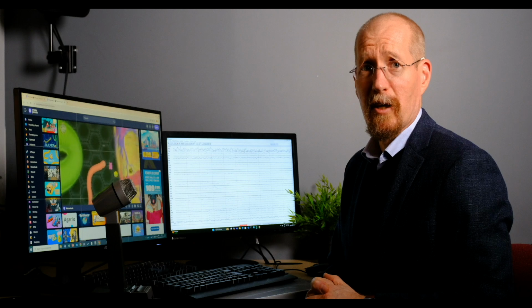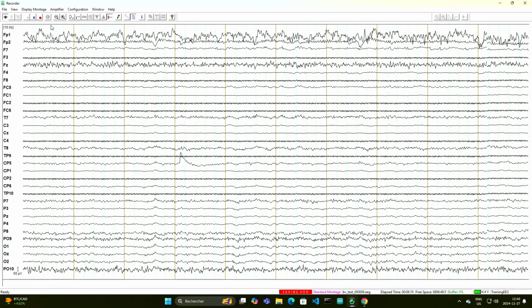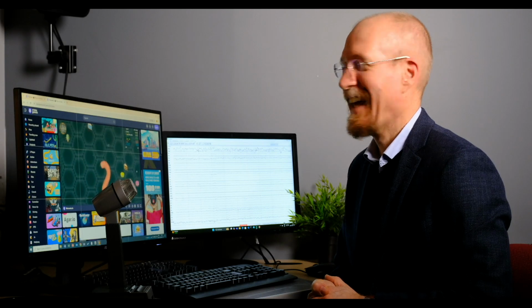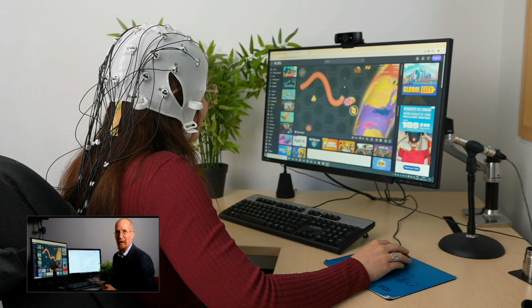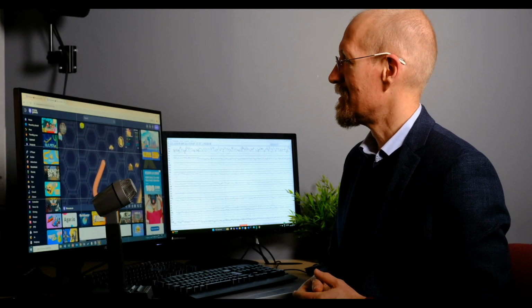Anne's caterpillar is getting quite large. You're good at this. Normally you don't talk to the participant during the study, unless it's absolutely essential.